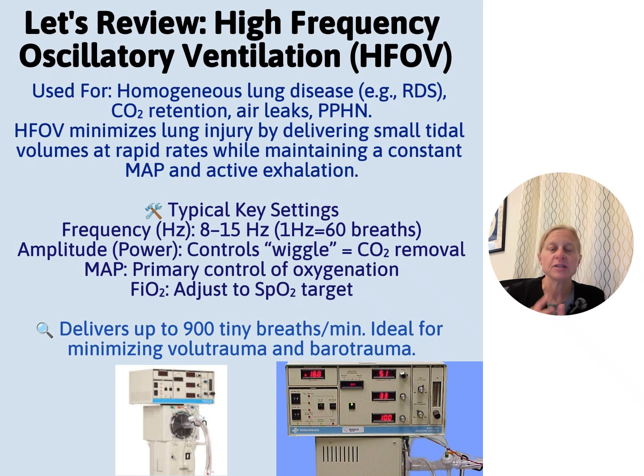The amplitude is the wiggle. That's the period of time that the CO2 has time to be removed and get out into that active exhalation. The MAP is your primary driver of oxygenation, and your oxygen again goes with your SpO2 target. We're really trying to decrease our barotrauma here. Remember that the MAP is doing the oxygenation and the amplitude is doing the CO2 clearance. That's so important. AMP, CO2, MAP, oxygenation. Did I say it clearly enough?